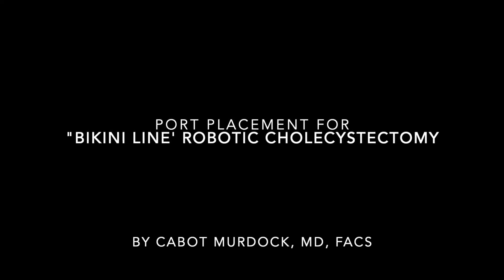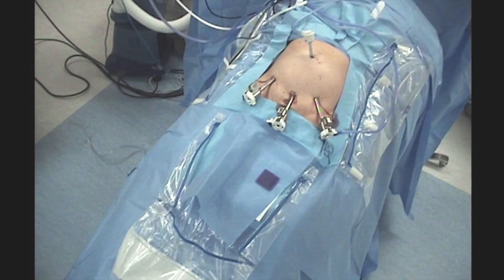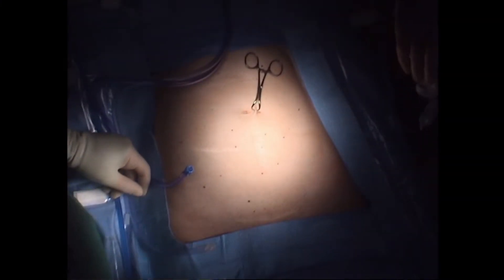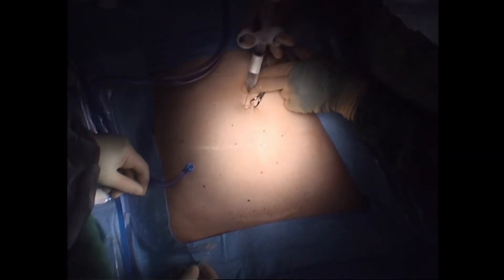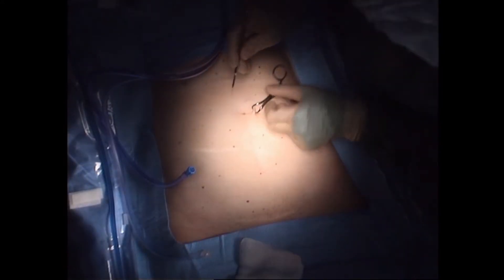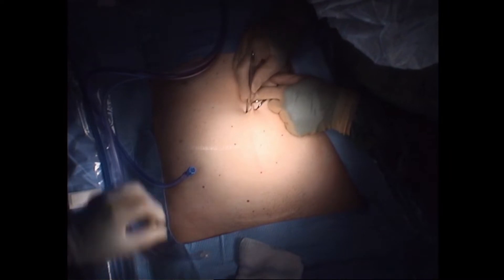This is an instructional video for the port placement for bikini-line robotic cholecystectomy. I begin by placing a towel clamp at the umbilicus and injecting 0.5% bupivacaine, followed by a small longitudinal incision and then insertion of the Veress needle into the abdominal cavity.